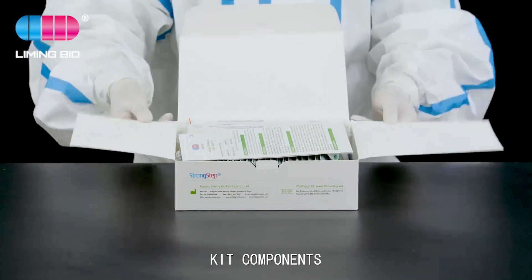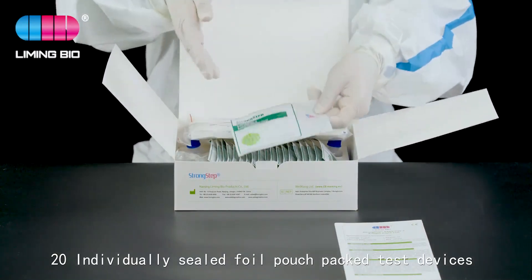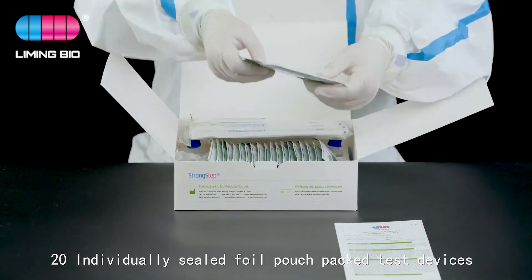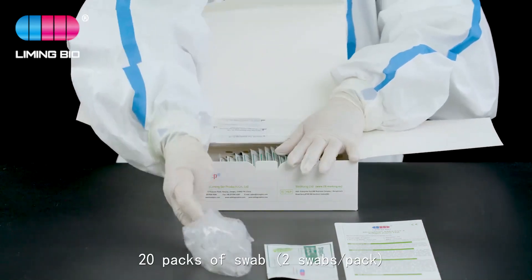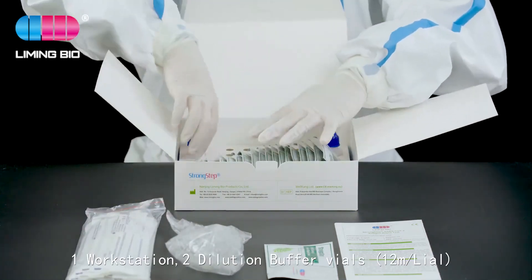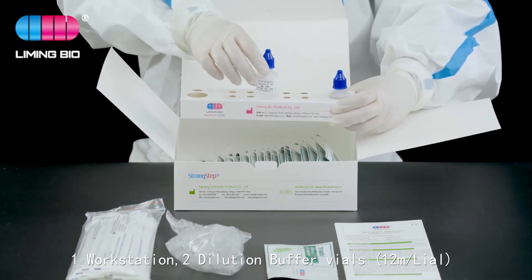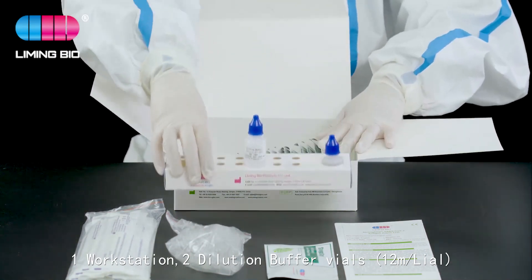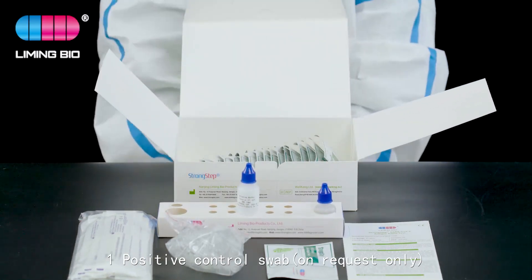Kit components: one package insert, 20 individually sealed foil pouch pack test devices, 20 extraction tubes, 20 packs of swab — two swabs per pack — one workstation, two dilution buffer vials at 12 milliliters per vial, and one positive control swab available on request.